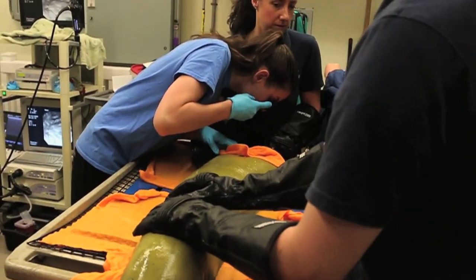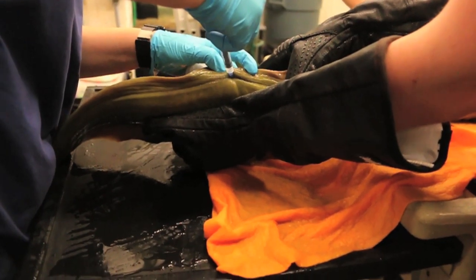Then they move on to blood collection so that we can evaluate what's going on with the internal systems of the animal and see how they're functioning, and then we'll also do an endoscopy.